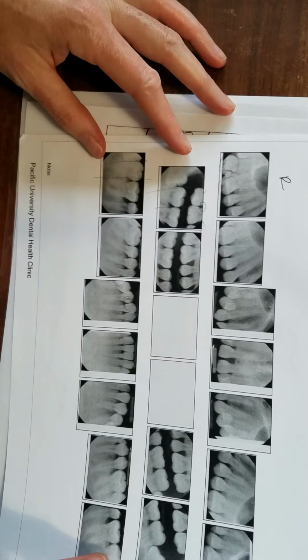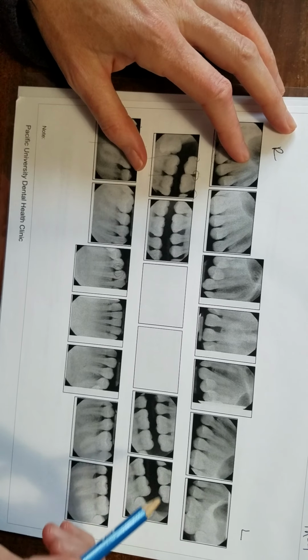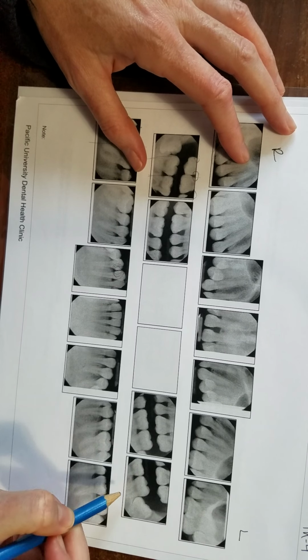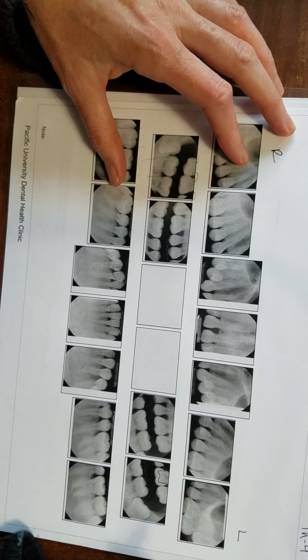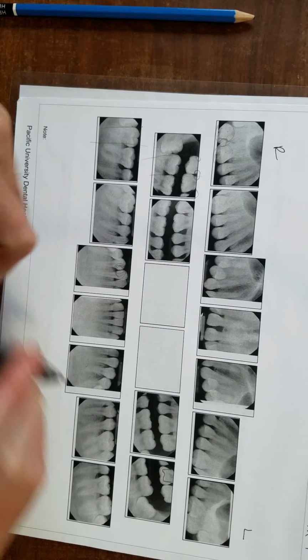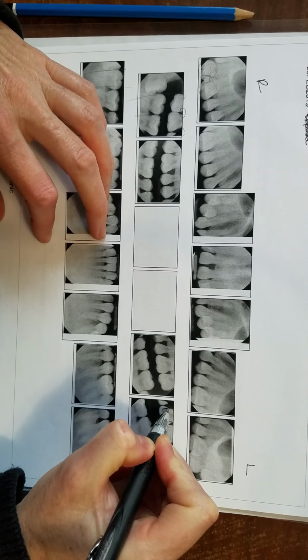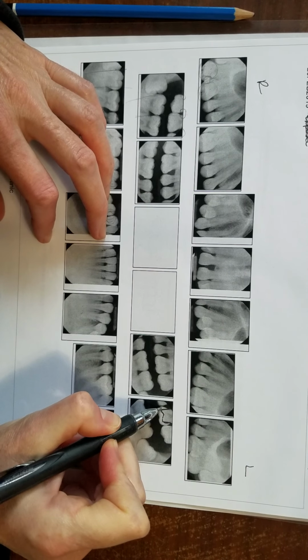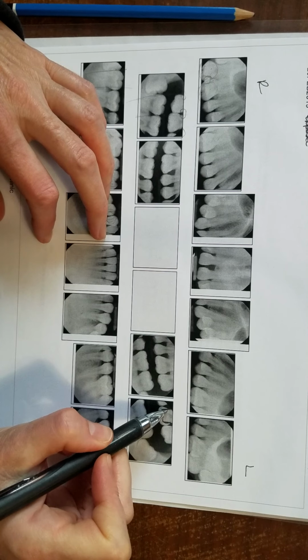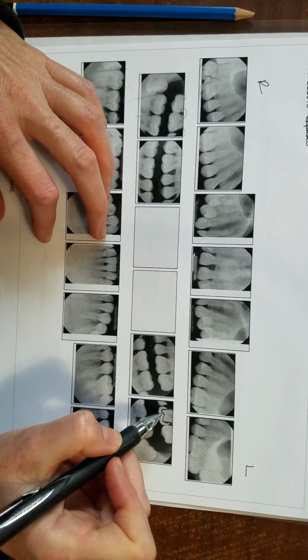Let me pull out my FMX to see if I can show you a clear one. These are very grainy because this is just a photocopy, but I can outline the enamel here, and so I've outlined the DEJ here. This is the DEJ. So this is the enamel, this is the dentin, and the DEJ is the dentin enamel junction. And so you want to be able to see that.